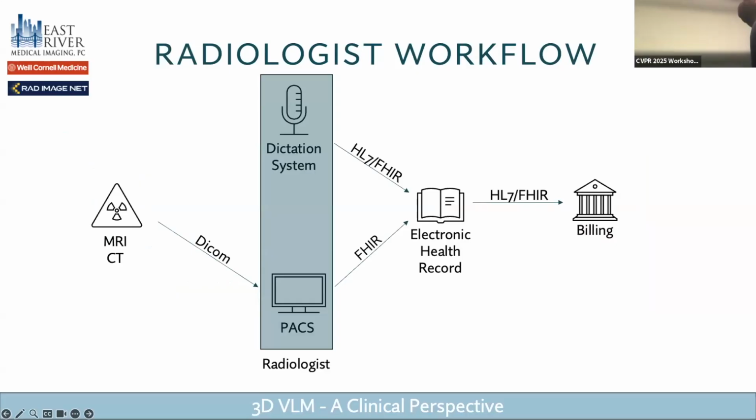So if I think about how I currently work, studies done on the MRI or CT, images are done through a DICOM transfer to our PACS system. This is where I'm sitting, right here. I'm sitting at my computer monitor with my microphone. So that's my dictation system. I dictate.